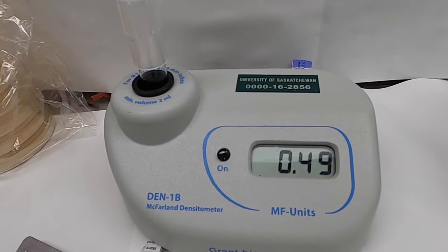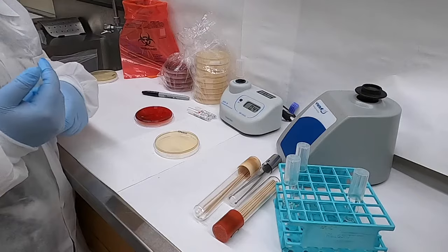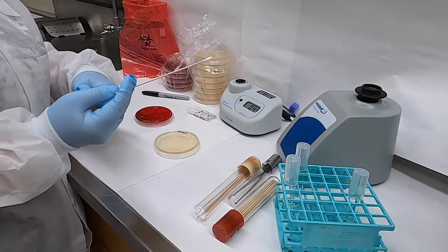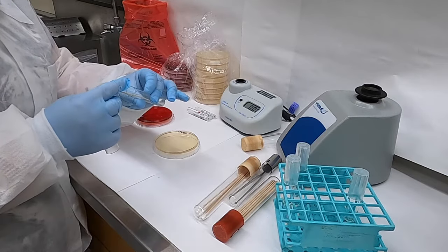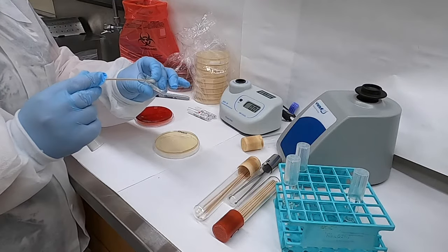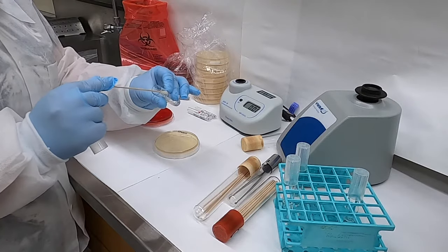So there we've got it, and we're ready to now inoculate our plate. We do this using a sterile swab. We start by first fully immersing that swab into our bacterial suspension and then wringing out the excess liquid on the side of the tube.